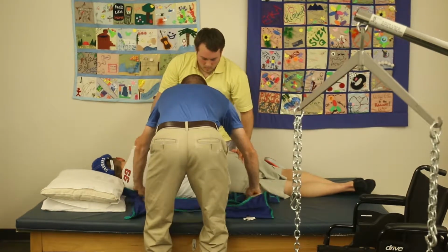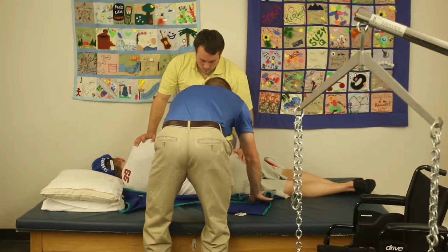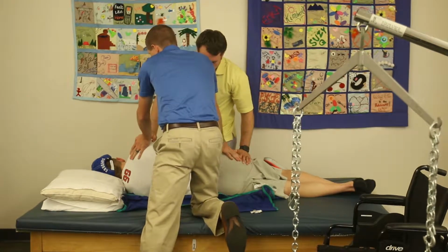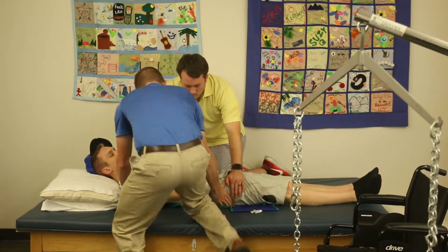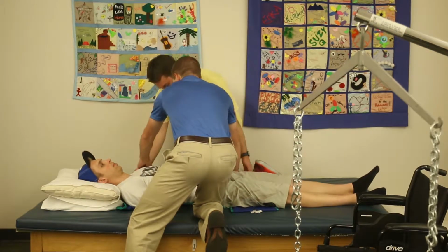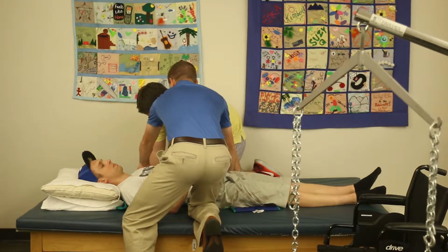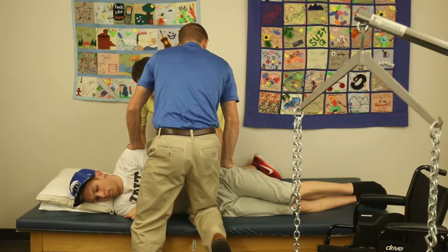So I'm gonna tuck this here just below you so you can roll back on it, and then we'll have it underneath you ready to go. Okay, as you're gonna roll back down, you're gonna feel a little bump. You're gonna come over that bump. So 1, 2, 3. Okay, now we're gonna do the same thing, but you're gonna come up to my side. So on 3, get your legs still good. 1, 2, 3. Okay, just pull that out for me there.